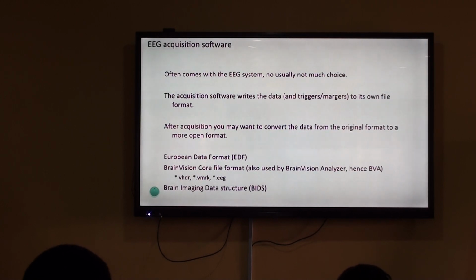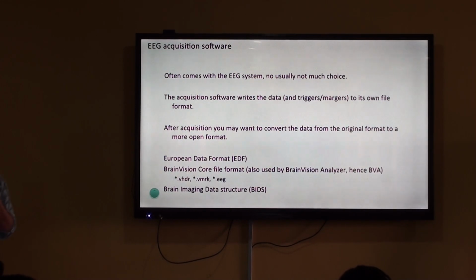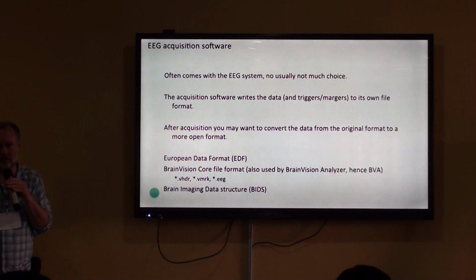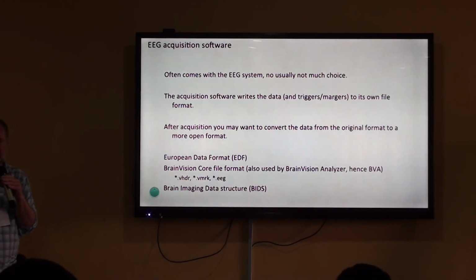And after acquisition, you may want to format the data or convert the data from the original format into a more open format. And this is especially relevant for clinical EEG. Clinical EEG systems are not very open. They often have file formats that are very difficult to read because the clinical companies are not sharing details of the file format.